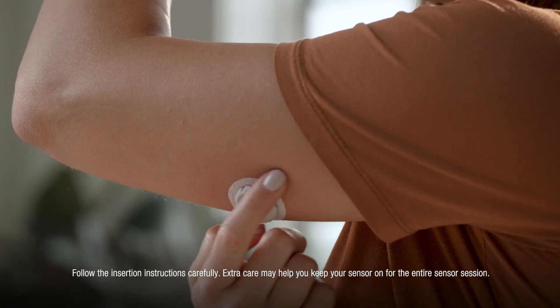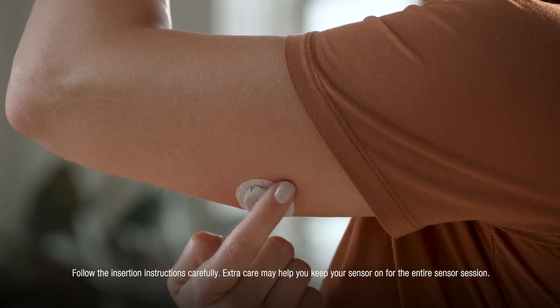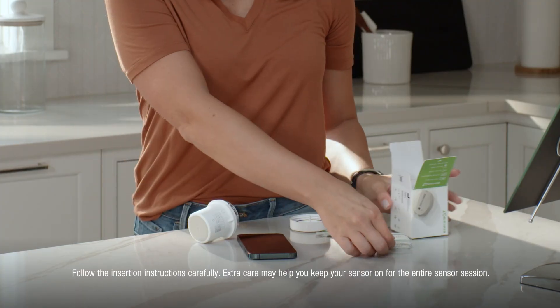To help keep the patch on your skin, press on the sensor for 10 seconds, then rub around the patch three times. Your overpatch will help you keep the sensor on and is bundled with your instructions in the box.